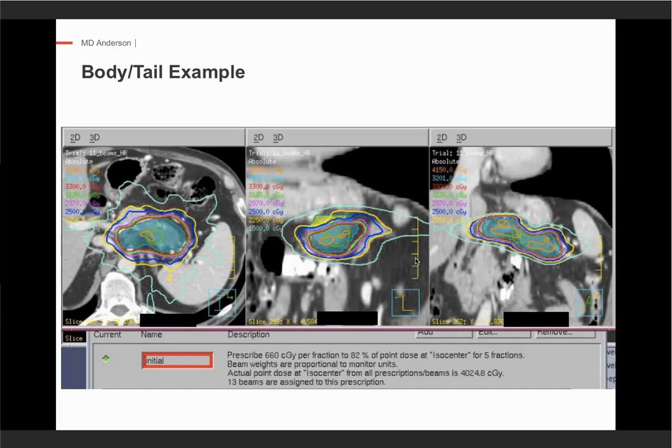One thing that's important to recognize is you can get what's called heterogeneous dose. So, for example, let's say I'm going to prescribe 40 gray. Gray is just a way we describe our treatment, so it's almost like milligrams of a medicine. But if we are treating 40 gray to this region right here, we can also say we want to treat the center core of the tumor to a higher dose, and we can make the beams of radiation give a much higher dose. You could see that parts of the tumor in here are getting above 40 gray, although the whole tumor is getting a certain dose.